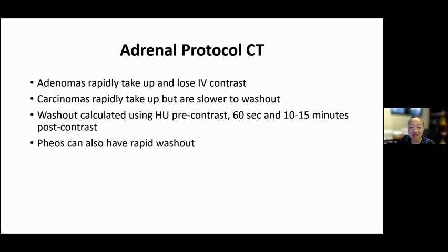Adrenal protocol CT scan runs by the concept that adenomas rapidly take up and lose IV contrast. Carcinomas also rapidly take up, but they are slower to wash out. Pheos can often mimic either adenomas or carcinomas, and so you really can't rule out a pheo using this adrenal protocol CT. Washout is typically calculated using pre-contrast Hounsfield units, 60 seconds after injection and 10 to 15 minutes post-contrast. Although these are fairly standard protocols, there can be some variability which can affect some of the studies, which I'll talk about in a second.